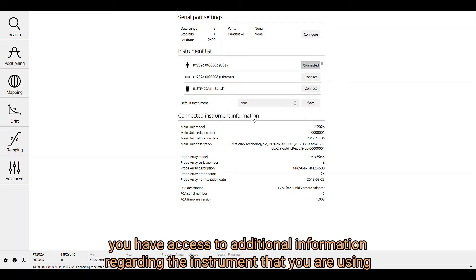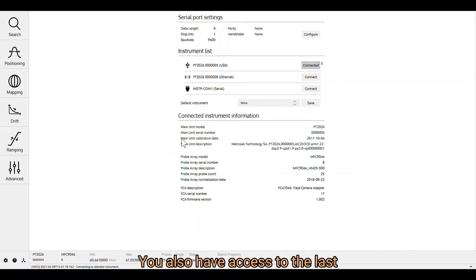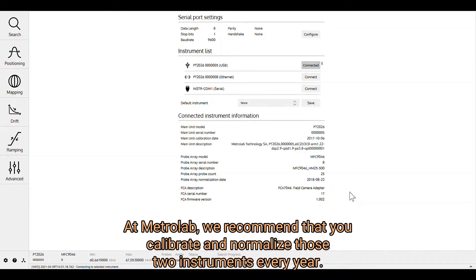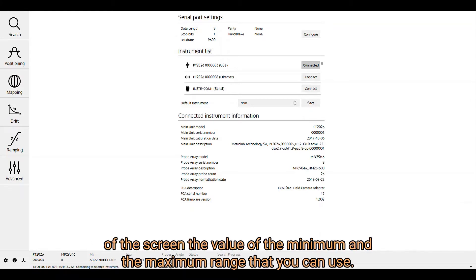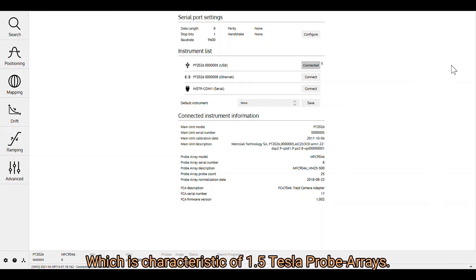Once you're connected, you have access to additional information regarding the instrument you're using: main unit, the model, serial number, and so forth. You also have access to the last calibration date of the main unit and of the probe array. MetroLab recommends that you calibrate and normalize those two instruments every year. At the bottom of the screen, you can see the minimum and maximum range expressed in megahertz — from 60.66 up to 67.05 megahertz — which is characteristic for a 1.5 Tesla probe array.